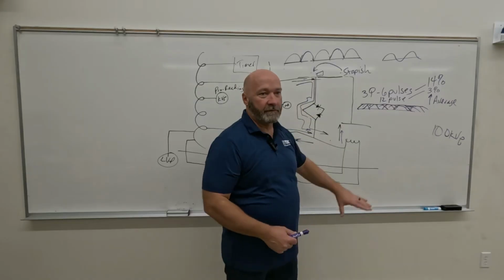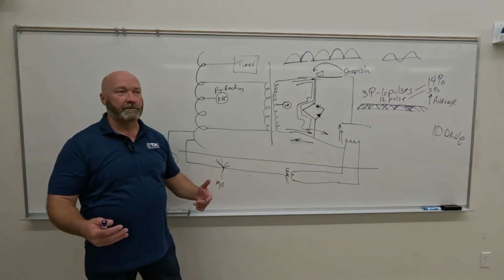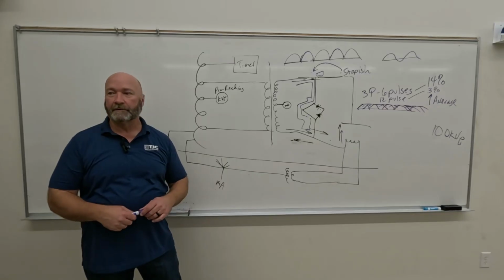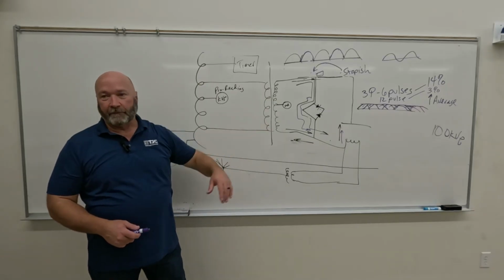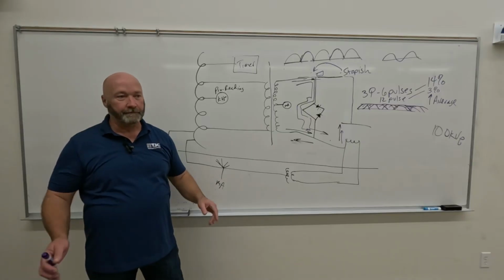So all this other stuff is probably eventually going to come off the registry, it's just not yet. The registry is always a little behind what the technology is, and even the textbooks in a lot of cases are kind of behind what the technology is updating with. But we've been at high frequency for a lot of years. At least single phase should be gone. It really should.